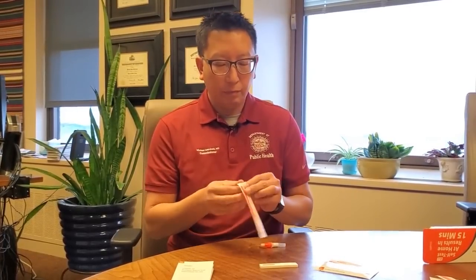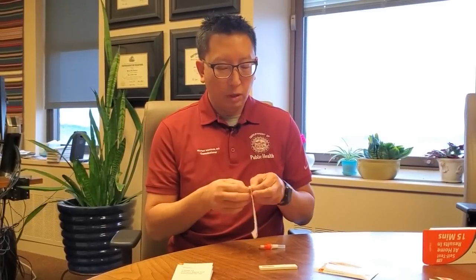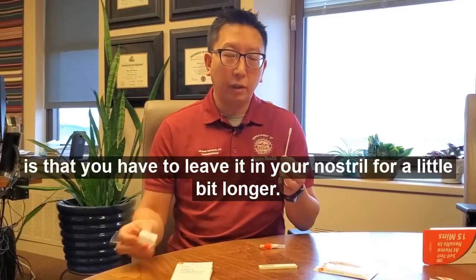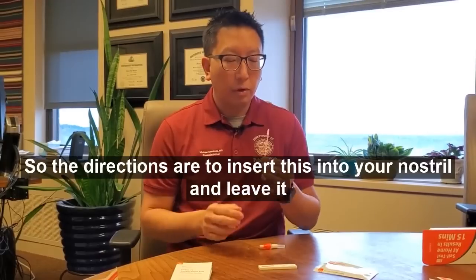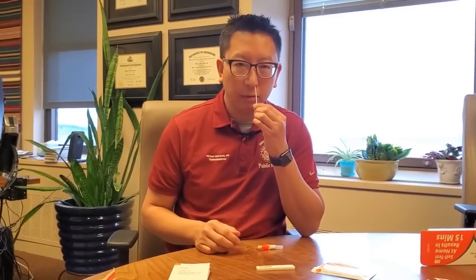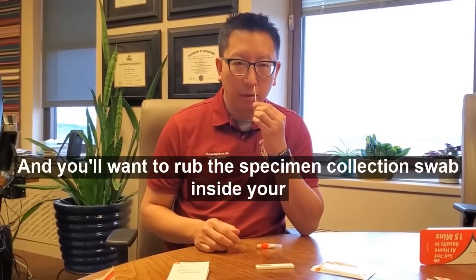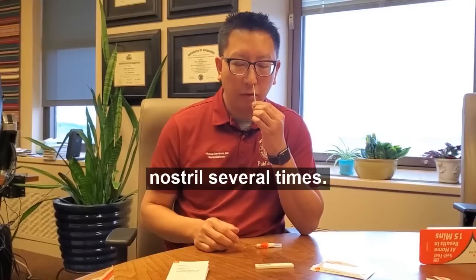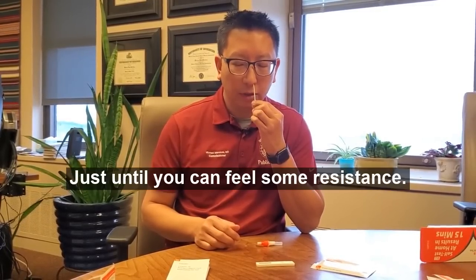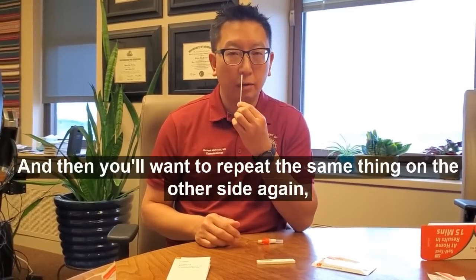To begin the test, open the swab. It's a regular Q-tip, but what's different is that you have to leave it in your nostril for a little bit longer. The directions are to insert this into your nostril and leave it inside for about 15 seconds, rubbing the swab inside your nostril several times just until you can feel some resistance. Then repeat the same thing on the other side, again for 15 seconds.